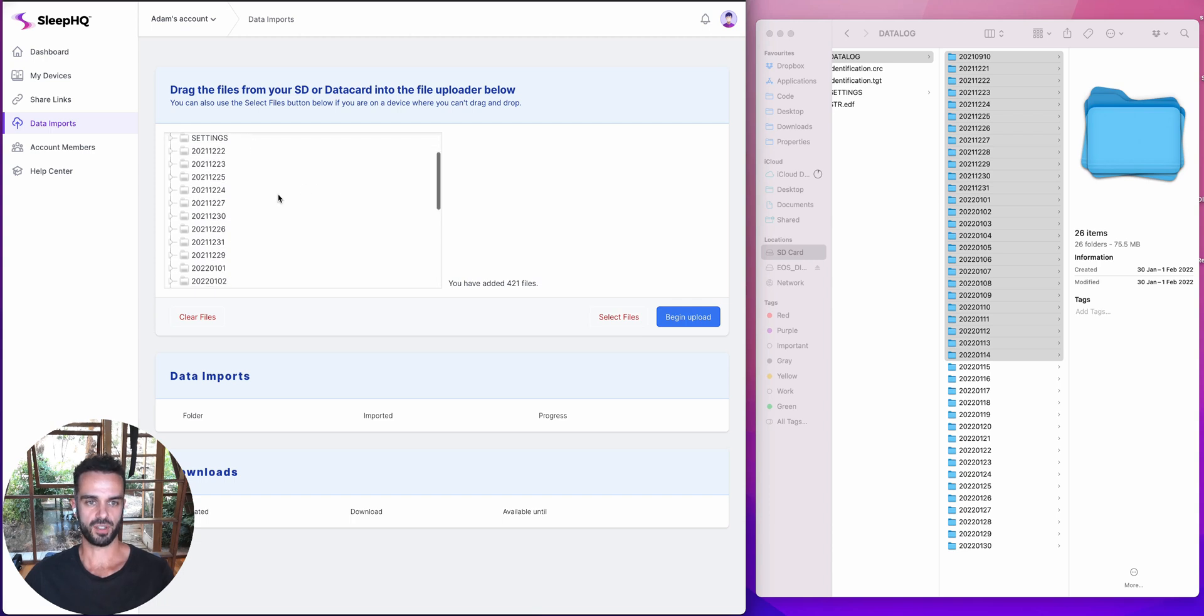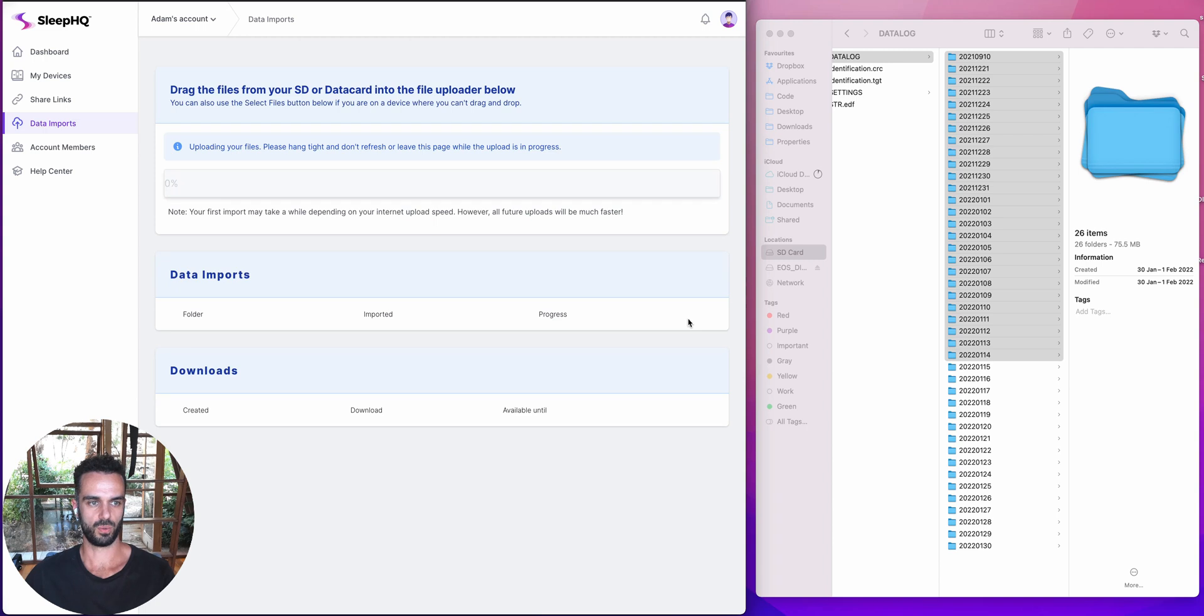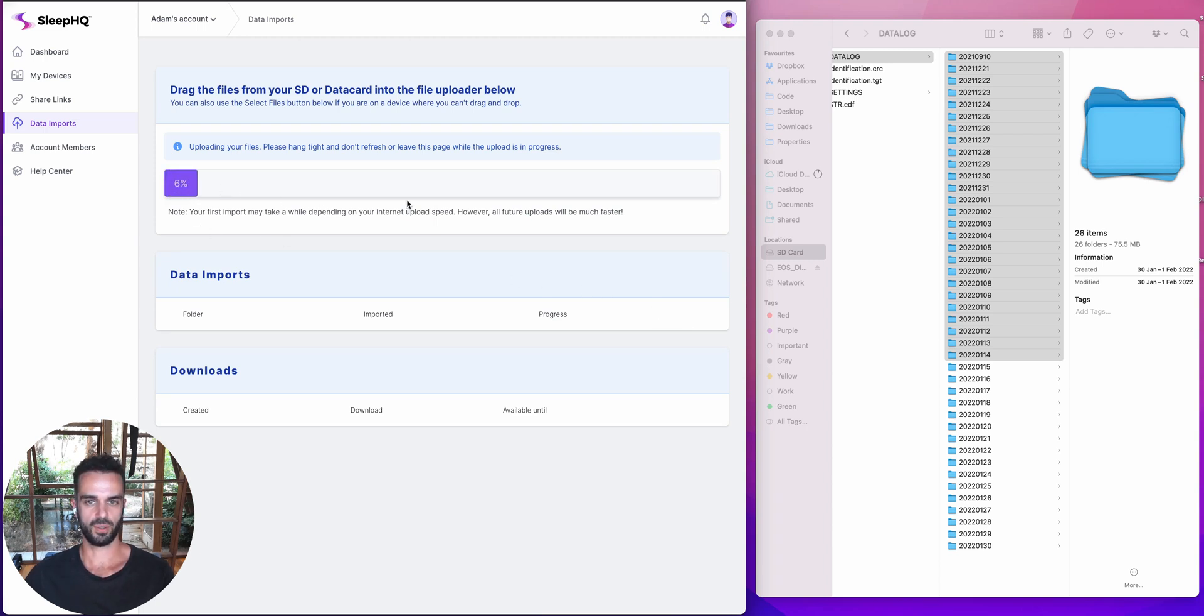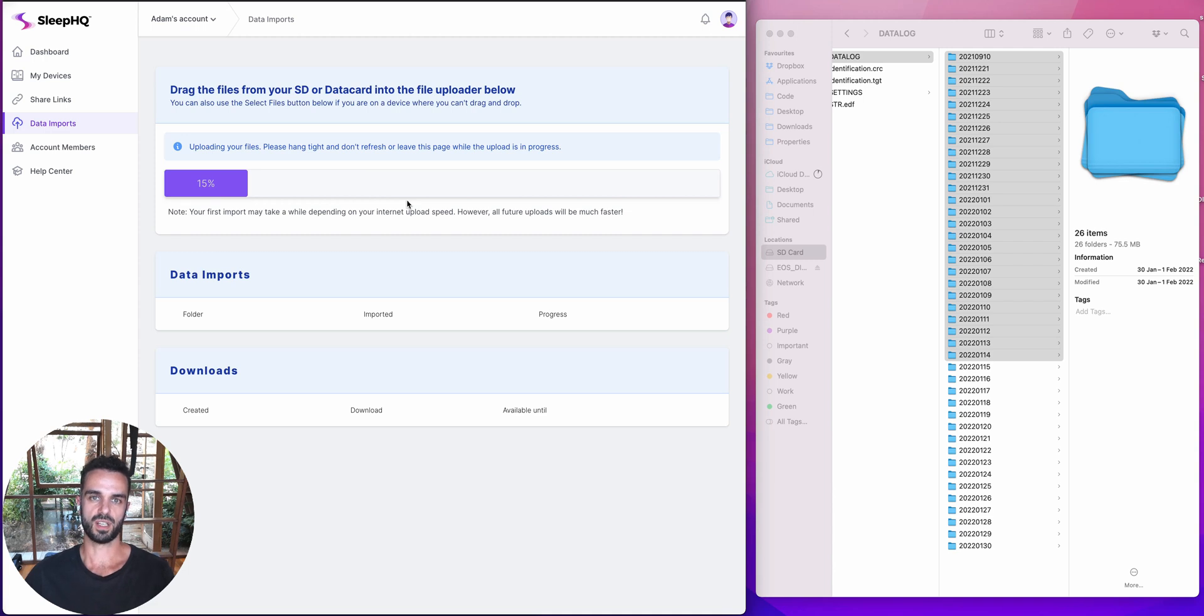Once I'm happy with all the files that I've queued up ready to go, I'm going to say begin upload. So we'll do that. And now my upload is actually processing. So I'm going to let that one run through. It's going to take a couple of minutes, depending on the speed of your internet connection will depend on how fast this goes. So the faster your internet connection, the faster the data is going to be uploaded.